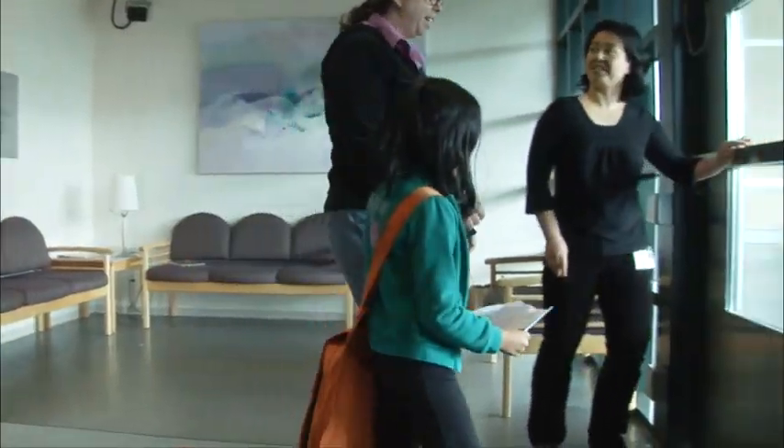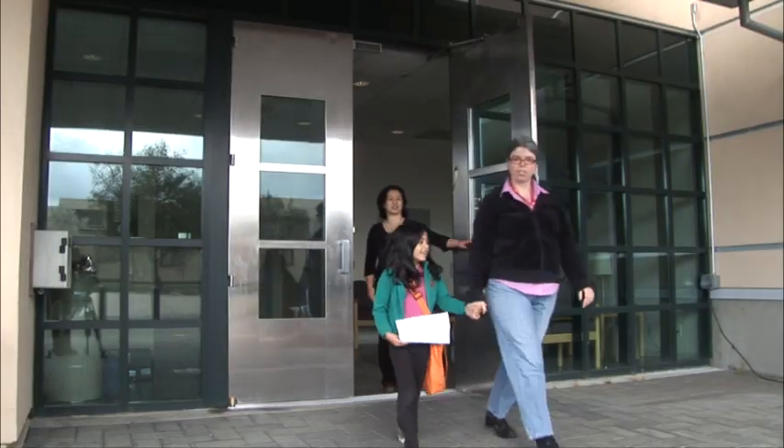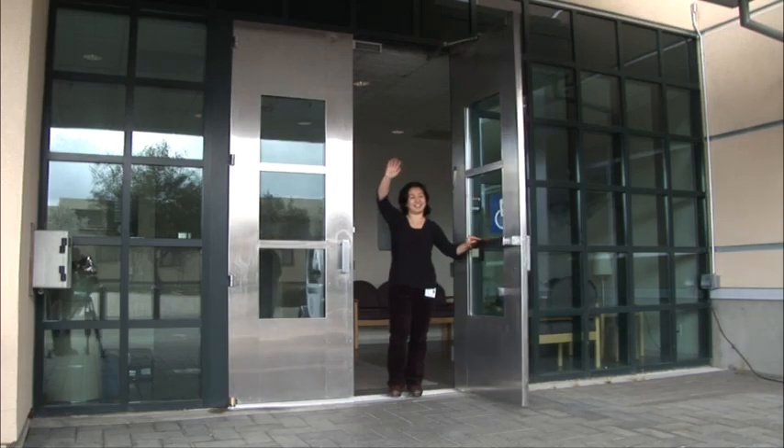Well, that's it. Once we have finished the scan and you have received your souvenir picture, then you are all done. Great job. Thanks for helping us with our study.